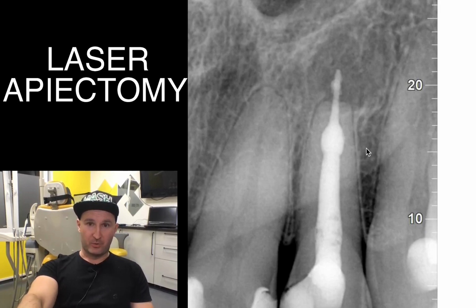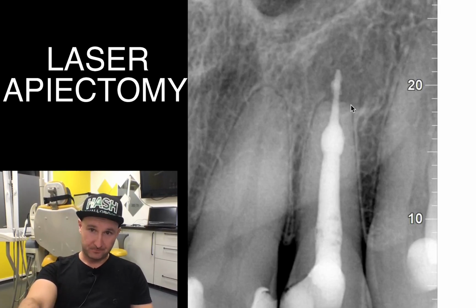On the X-ray we can see that there is extruded filling material over the apex, and we can see that maybe in the past there was active process of internal inflammatory resorption, I guess.